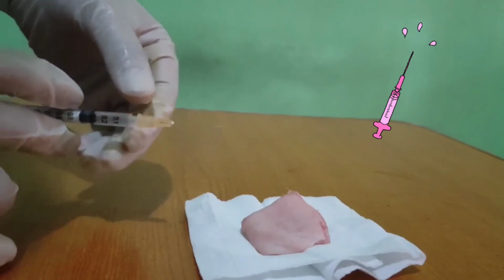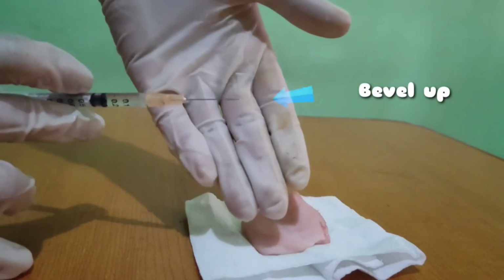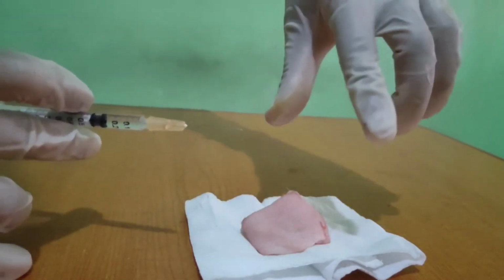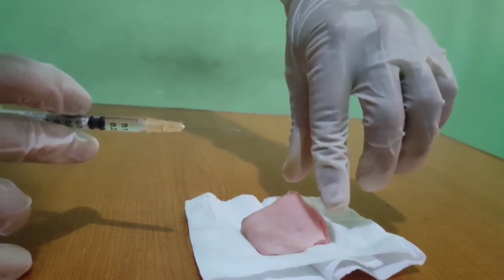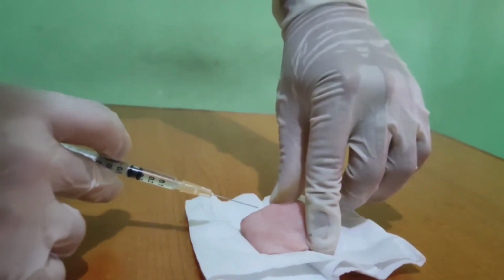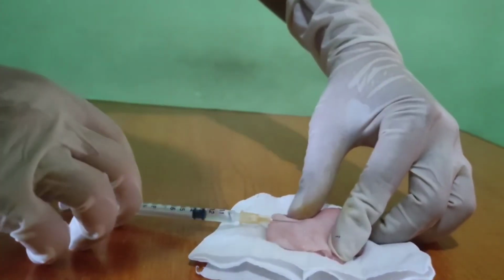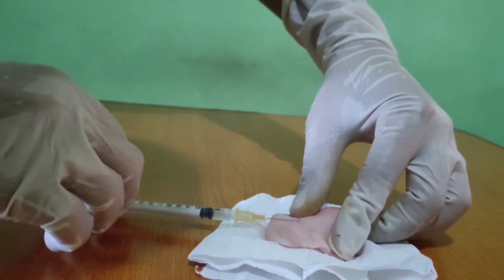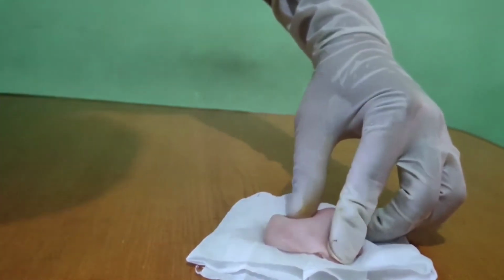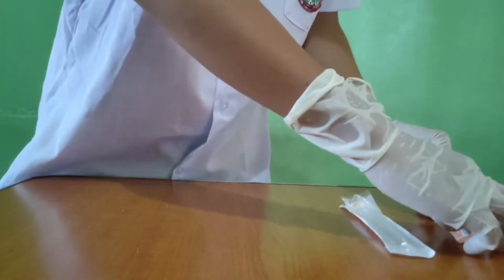But first, check that the needle bevel is facing up. Put your non-dominant hand on the skin of the patient and make sure the needle is at a 5 to 15 degree angle. When injecting, make sure there is a small bump called a bleb. And always remember that you don't massage the injected part.